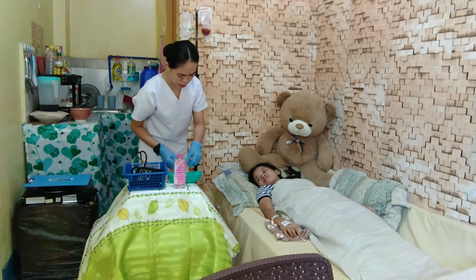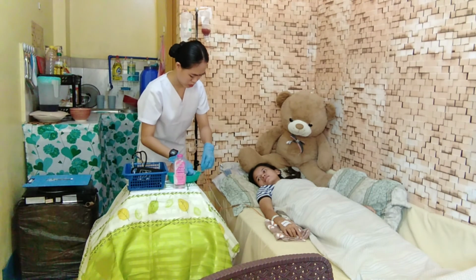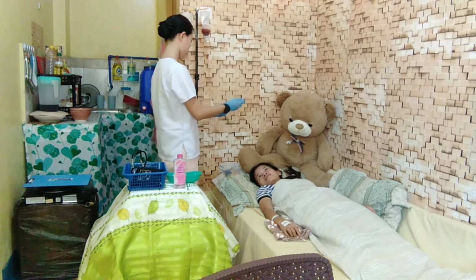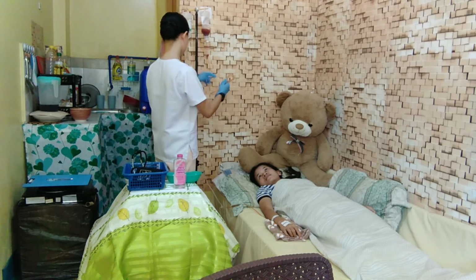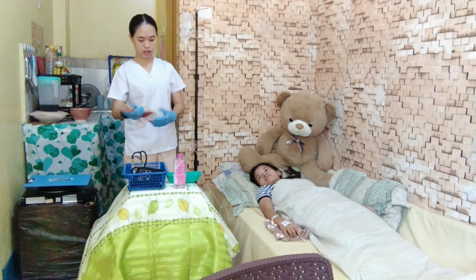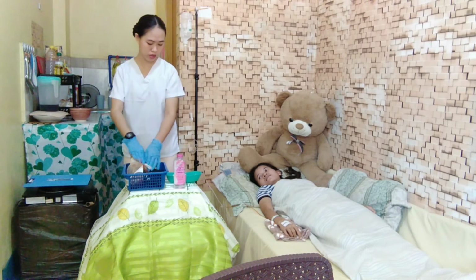And we're going to close, and dispose of it properly according to the agency protocol.